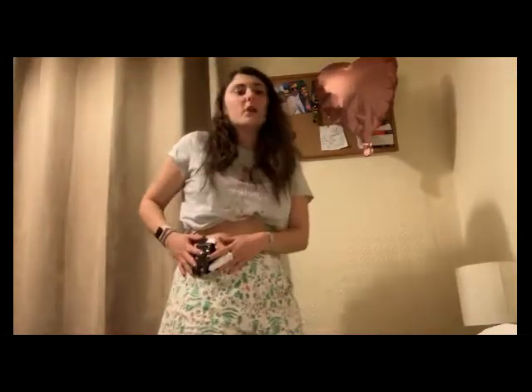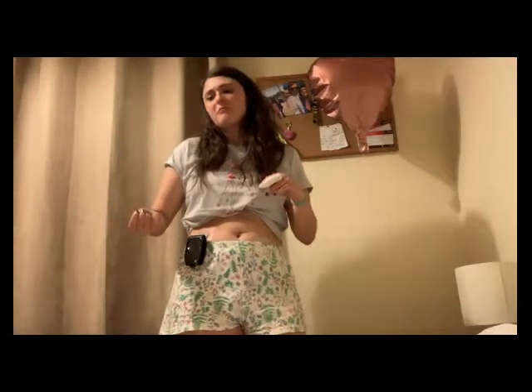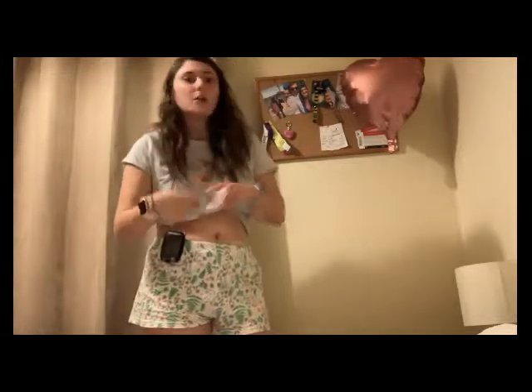So then, as you saw, I prefer it this way. Some people prefer it another way. I prefer it this way because when I do my phone way, I tend to forget to scan it. Sorry, you can't see my face. I tend to forget to scan it, and I just become very lazy. When it's on here, I can feel it vibrate. So if I input my carbs and stuff, it'll say, even if you don't want to input your carbs, I do anyway, because it plots it on the chart, and then I'll go, oh, maybe it's my dinner that caused this, because I'll know what medication, what insulin, and what carbs I've had.